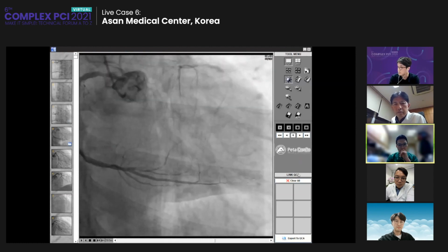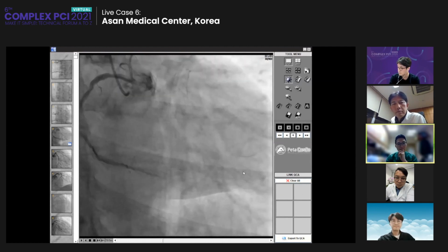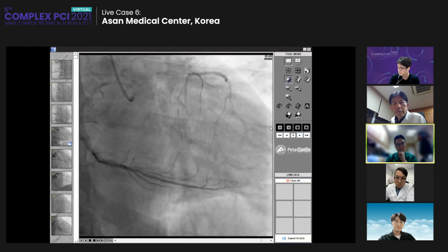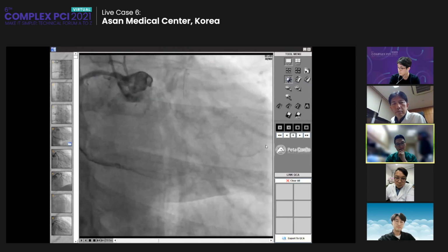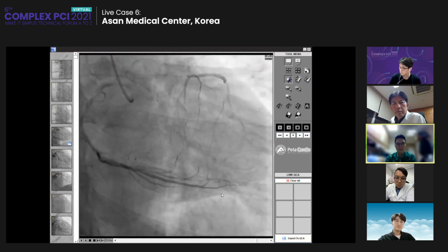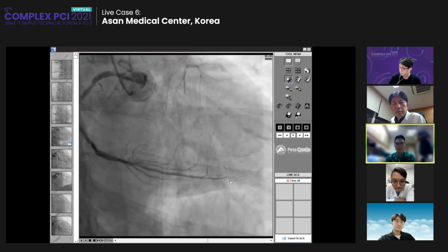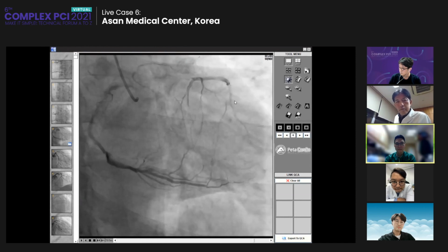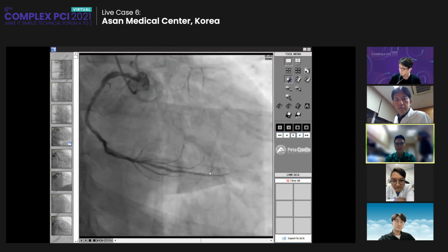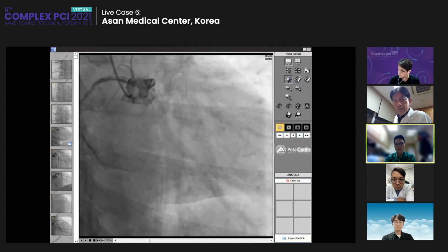So this is a counter view, and you can see that we can see some available septal collaterals that can be used for the intervention. It was not accurately shown in our angio, but according to the other hospital's angio, there are some potential septals to use. Especially, we can see another good septal collateral candidate at the distal portion, which is connected to the more distal portion of the LAD.